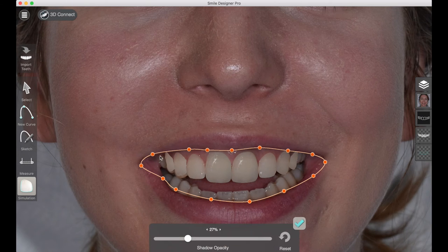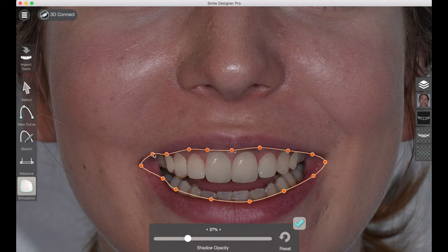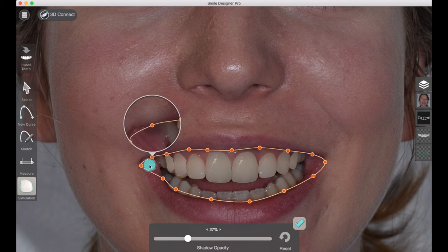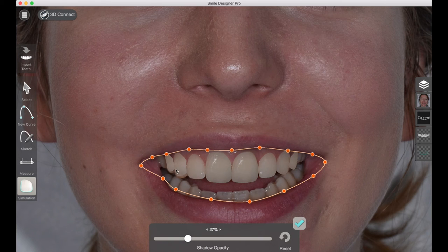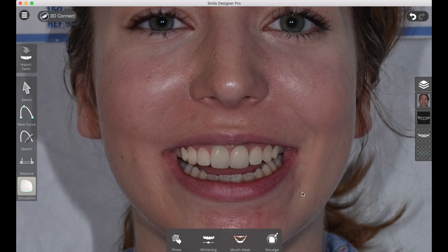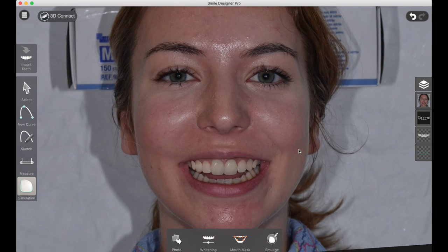Here we're going back to the lip mask to tweak the contour so that it cuts the tooth so it appears to actually be in the mouth. And that's looking a lot better.